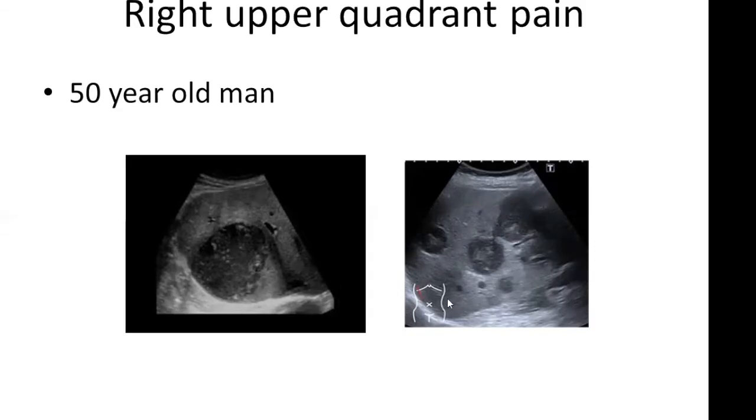Equally, there's another patient here with another finding, and lots of multiple soft tissue abnormalities, no temperature, with weight loss, and these are most likely due to tumour. It can be benign or malignant, but this looks malignant. Primary or secondary? Well, there are multiple, most likely secondary. We'd examine the abdomen to look for a bowel mass.